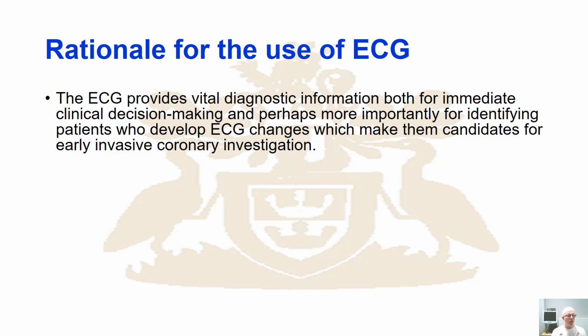So to that end, what we understand is that the ECG, as we've got here, provides vital diagnostic information, both for immediate clinical decision making and, more importantly, for identifying patients who develop ECG changes which make them candidates for, say, early invasive coronary investigation. So this really alludes to the clinical population group.